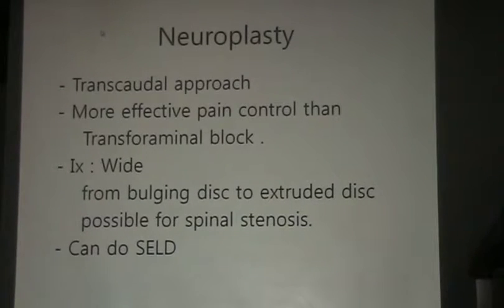Next topic is epiduroplasty. Epiduroplasty can be done under the transcaudal approach, as you know, and has more effective pain control than the transforaminal one. The indication of epiduroplasty is wide, from bulging disc to extruded disc, and it can be possible for spinal stenosis. If you can do epiduroplasty, you can do transsacral endoscopic laser decompression, SELD.